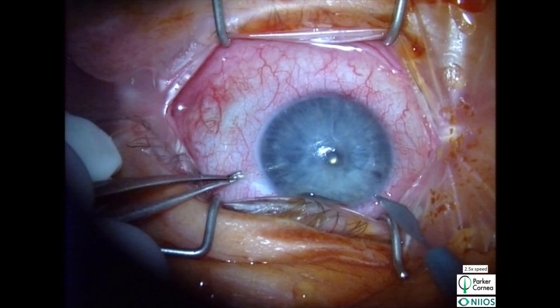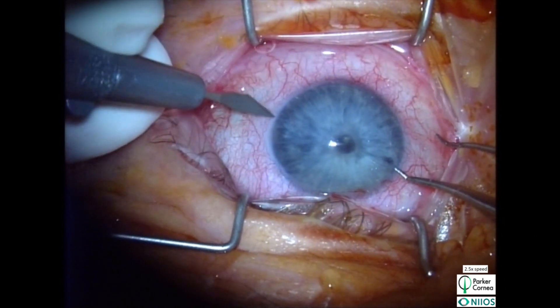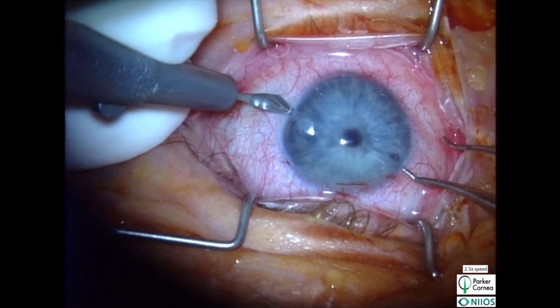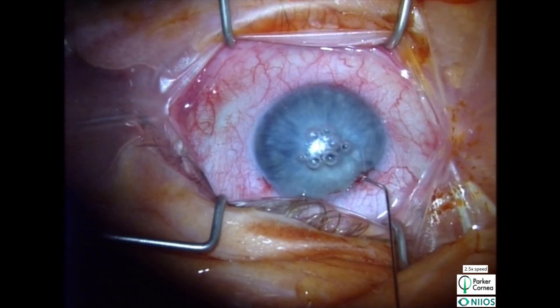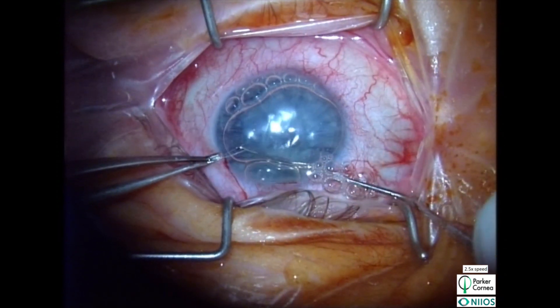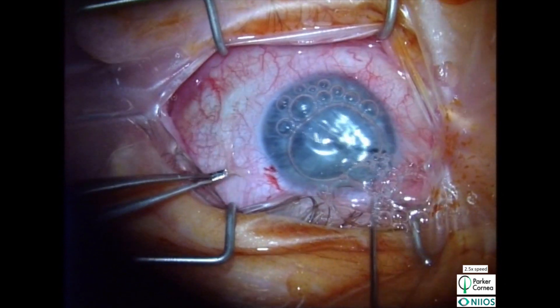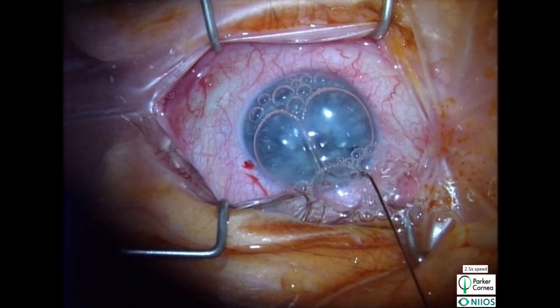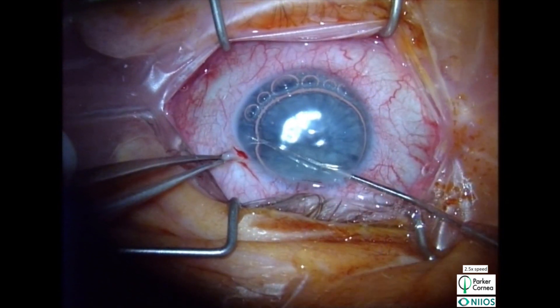As with many DMEK cases, we begin the surgery by creating a paracentesis in three quadrants. We then fill the anterior chamber with air to help with visualization. Using a reverse Szynski, we make a descematorrhexis that is slightly smaller than one made in conventional DMEK, being careful not to deeply score the posterior stroma.